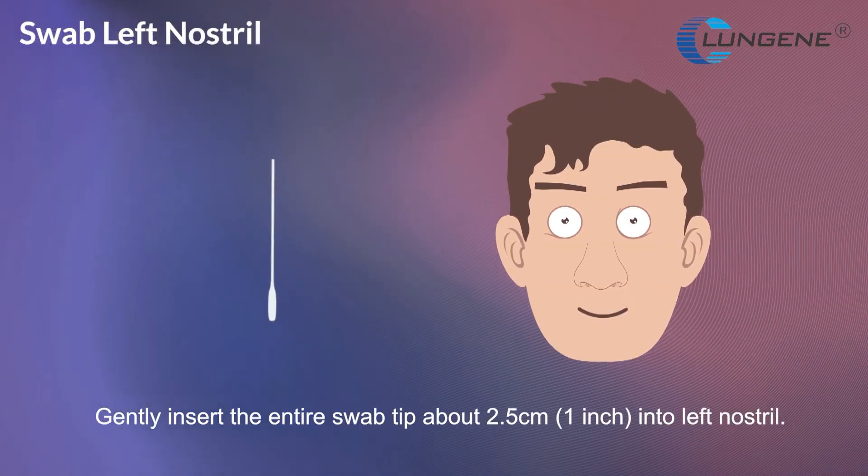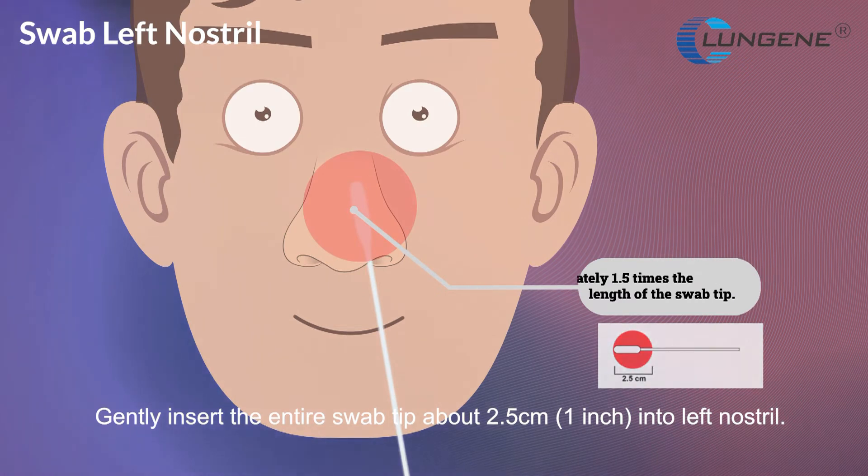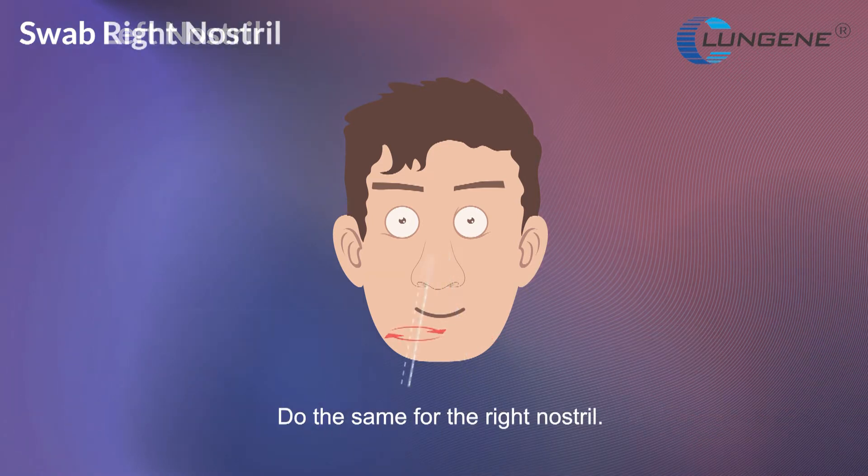Gently insert the entire swab tip about 2.5 cm (1 inch) into the left nostril. Firmly brush against the inside of the nostril in a circular motion 5 times or more. Do the same for the right nostril.